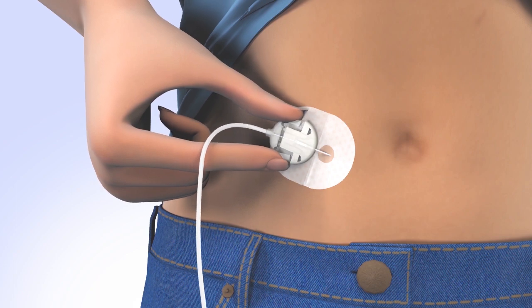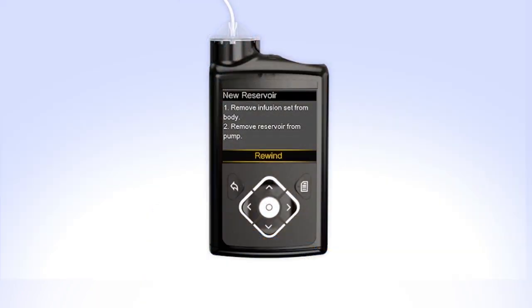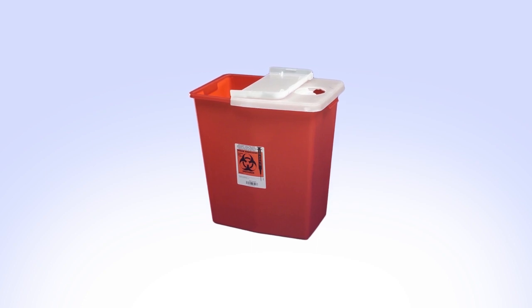Disconnect the infusion set you are currently wearing and remove it from your body. Remove the reservoir from your pump by turning the tubing connector counterclockwise. Safely dispose of the used infusion set and reservoir.